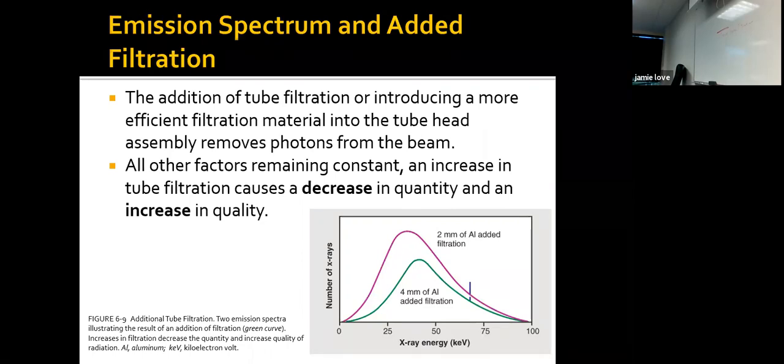Digital is so much better, you guys, than film. With film, you would have to have this light, we call it a hot light, and you hold the x-ray up to it and try to see the area that's too dark. If it's thick, don't you want the higher energy beam to penetrate? Yeah, but the other parts, like a little thin piece of bone, are going to be burned out, too dark, because we use too much penetration. So that's what the filters do, they help even out the uneven body parts for the beam.